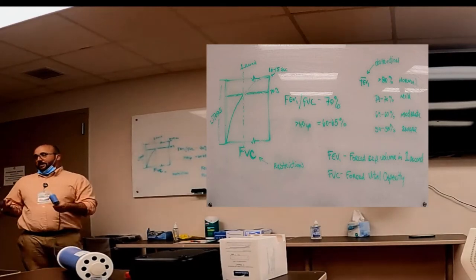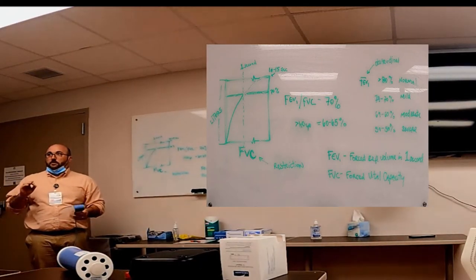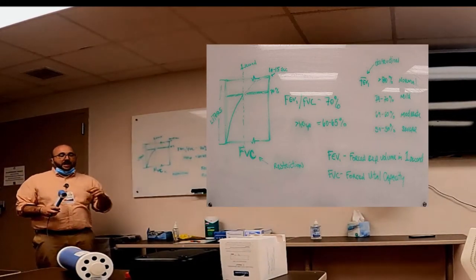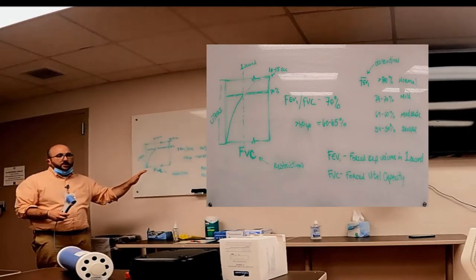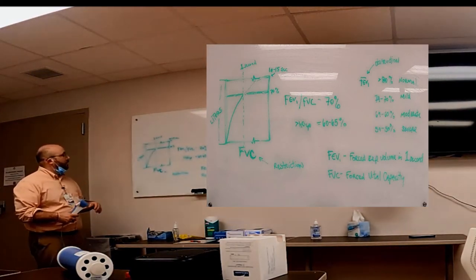And I breathed back through that. I didn't breathe back through it really well. But you can tell I ran out of air really fast. You can't just make them run out of air and stop. They've got to keep pushing. And there's actually a counter, I'm sure there is on your computer too, to see 10 to 15 seconds of exhalation. So it's really important to do that.